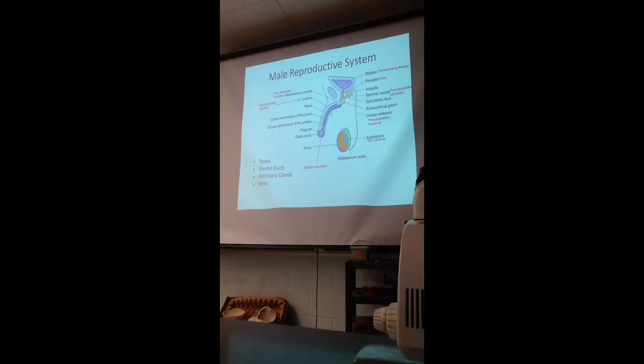Okay, Anthony has written, I think this slide is there in your blackboard, but Anthony has modified it a little bit, adding different types of epithelium in this slide. Epididymis: tall columnar cells or pseudostratified cells, but the giveaway is stereocilia. Ductus deferens, pseudostratified columnar epithelium.